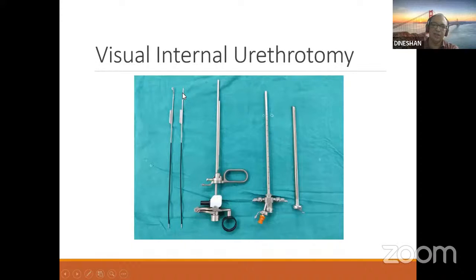You advance the knife by the working element through the narrow lumen, depress this part so that the tip is elevated, and then release, so that the stricture will be cut.